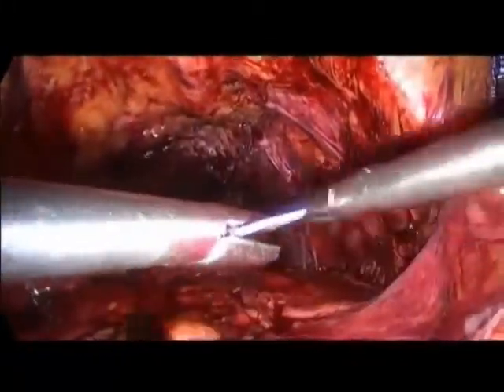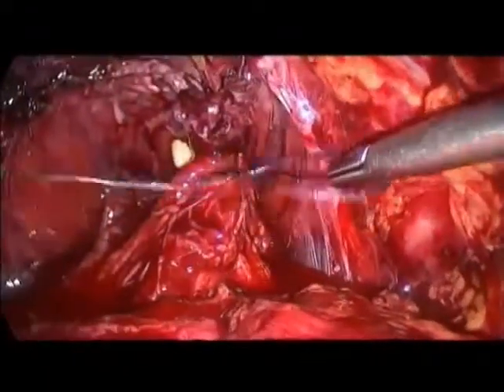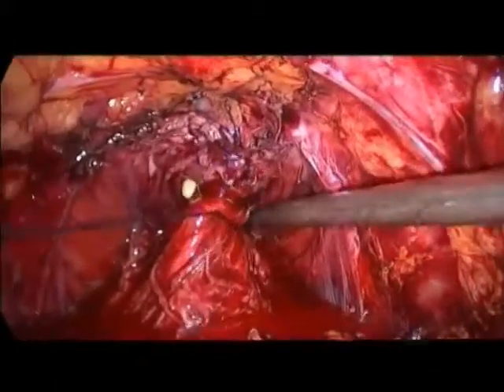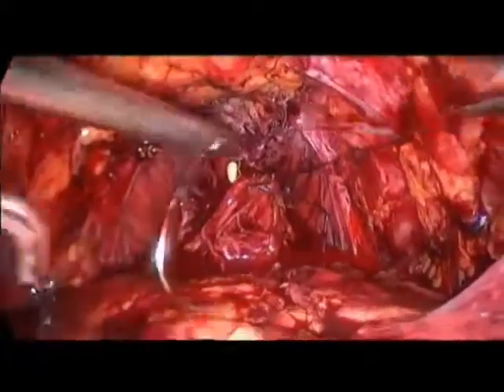relevant to support the posterior aspect of the sphincter, because we know from the histochemical studies made by Myers that this part of the sphincter is quite thin. So if it drops behind the urethra, we can understand that it doesn't help early continence.